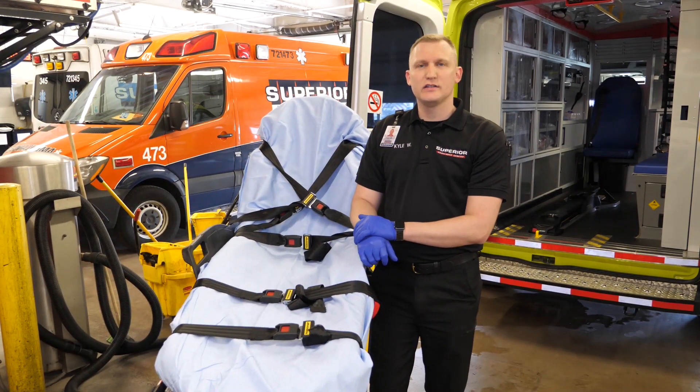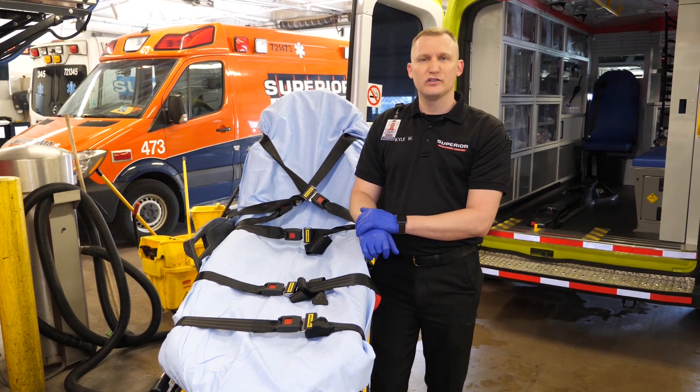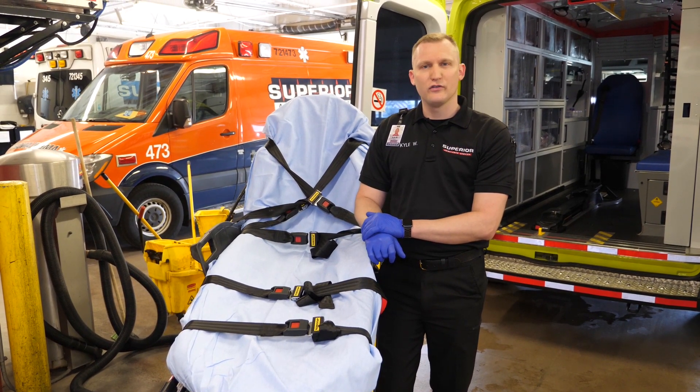That completes our decontamination process of the ambulance. As always, if you have questions, please refer to your station manager or you can ask the logistics department, as we are always here to help. Thank you for everything you guys are doing through this COVID-19 situation.